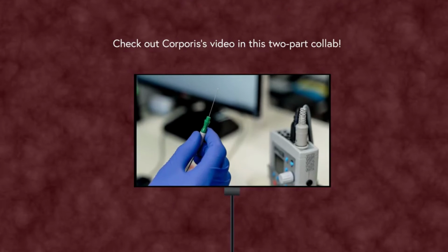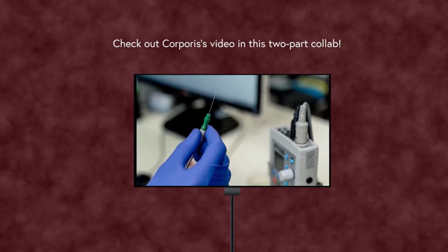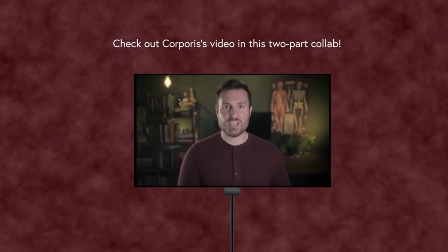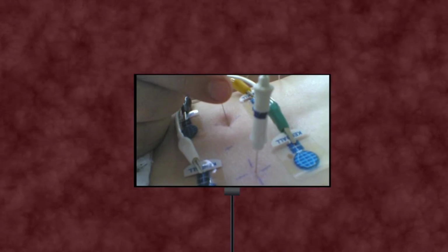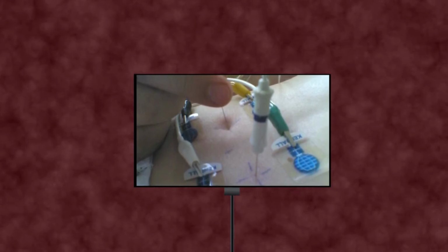Also inserted EMGs, which use a needle or wire stuck into the skin. That lets the user analyze deeper or more delicate muscles that might be overpowered by the bulkier muscles during surface EMGs. These things are mostly used for neurological studies and sometimes in PT clinics.